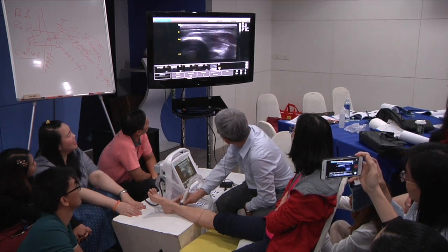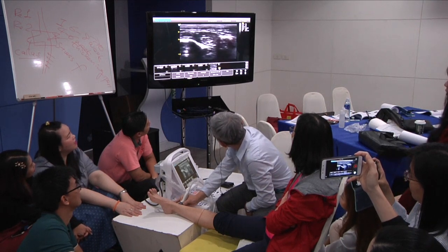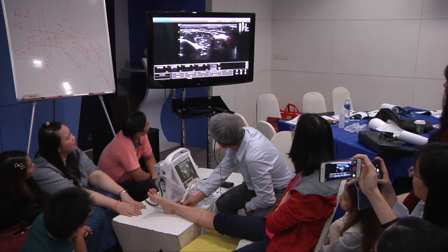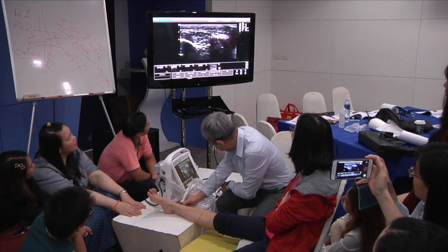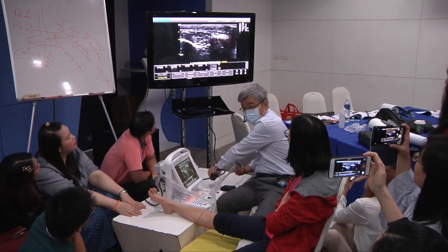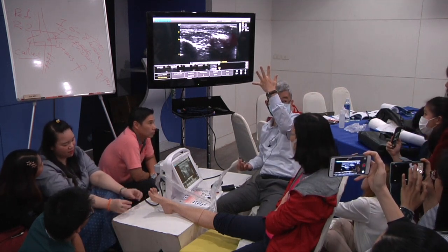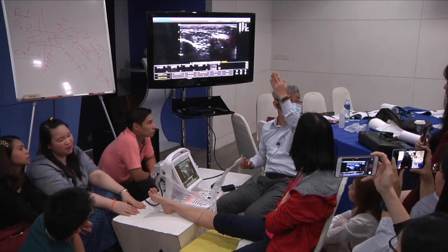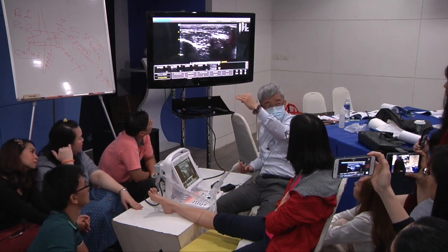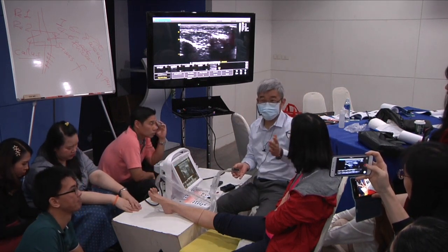Tibialis anterior, extensor hallucis longus, right? Okay, my new boyfriend, he is very young, so the size is very small. I mean the tendon size. The tendon size is very small. Good, and very superficial. Because the extensor digitorum longus tendons have a lot of branches, the size is very small, right? Tibialis anterior, tough. Extensor hallucis longus, tough. So you need to trace, observe the 3 muscles, 3 tendons.